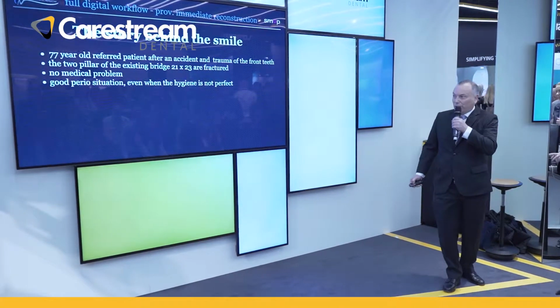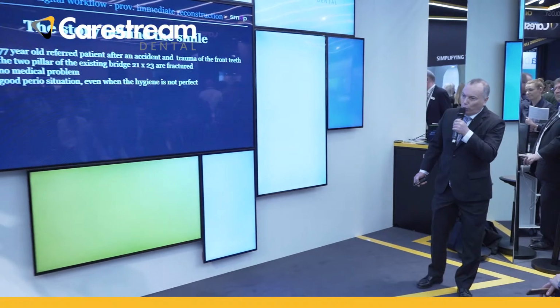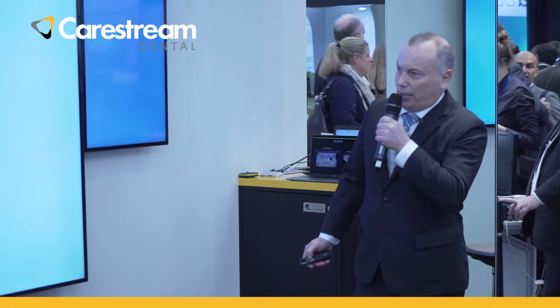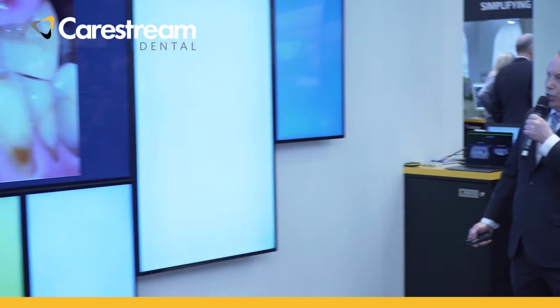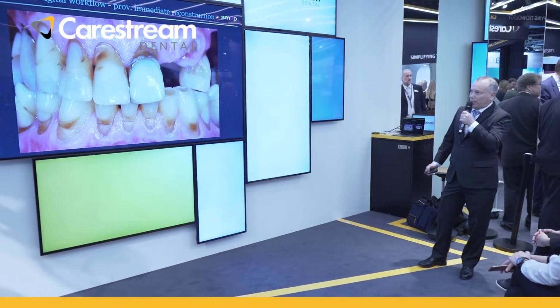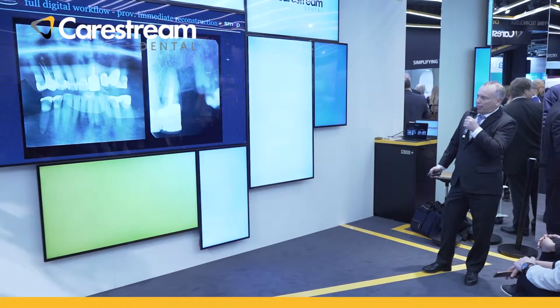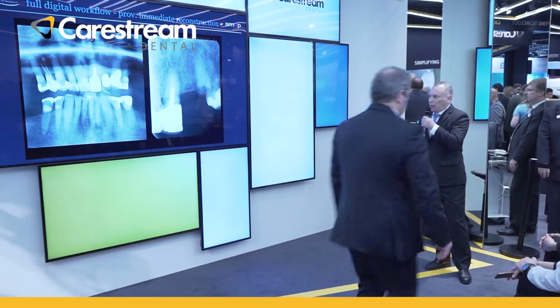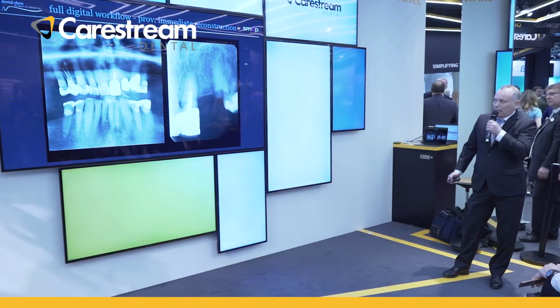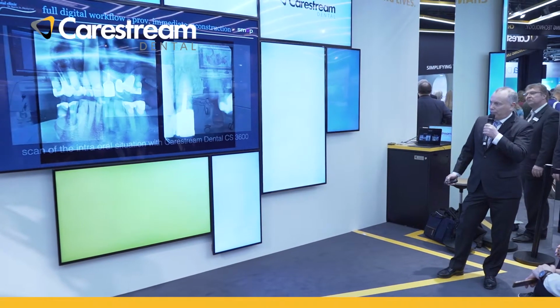He had a big gag reflex and a good perio situation, and even though his hygiene was not perfect, I chose him for an immediate reconstruction. This was the first time I saw the patient. The crown on number 2-1 was only provisionally re-cemented. We took the intraoral pictures; this was the start panoramic on the left side and the single X-ray on the right side. We could not save these two roots, so we had to go for implant dentistry.